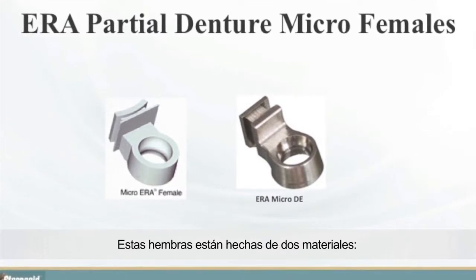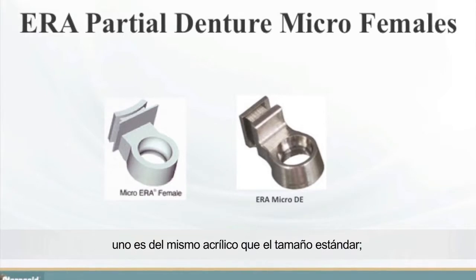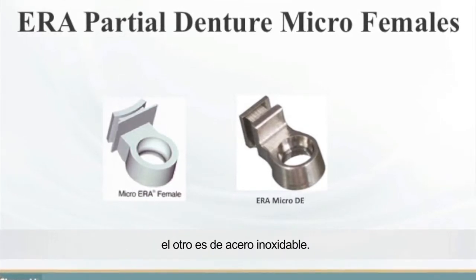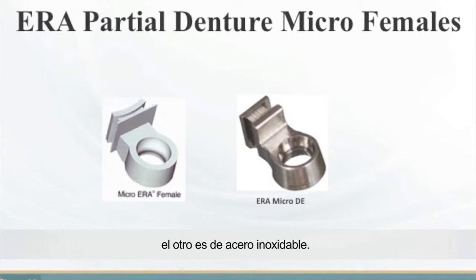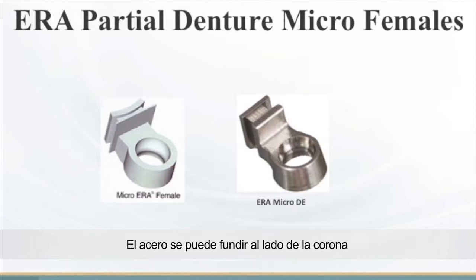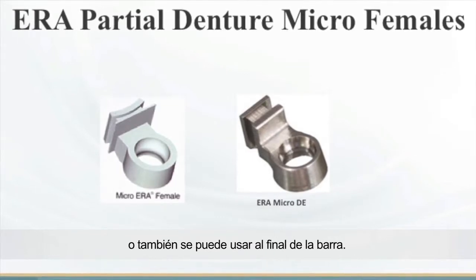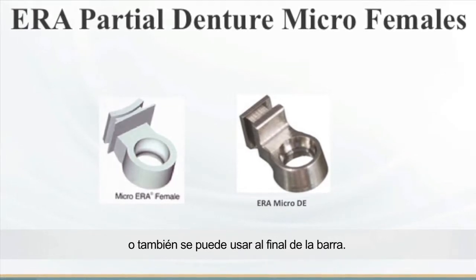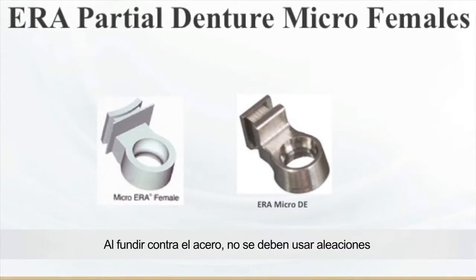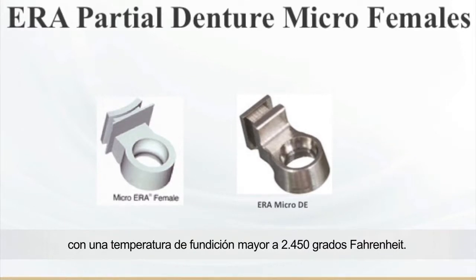These females are made from 2 materials. One is the same acrylic as the standard size, and the other is made from stainless steel. The steel can be cast to the side of a crown or is also used off the end of a bar. When casting against the steel, you must not use alloys with a casting temperature above 2450 degrees Fahrenheit.